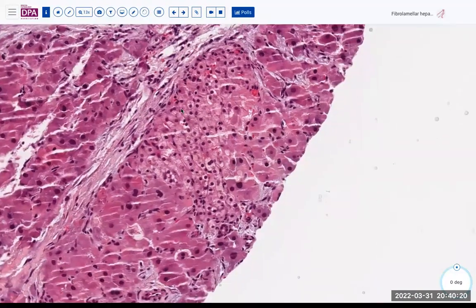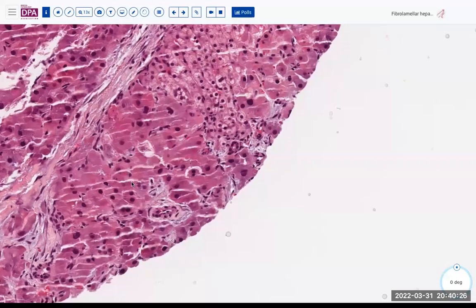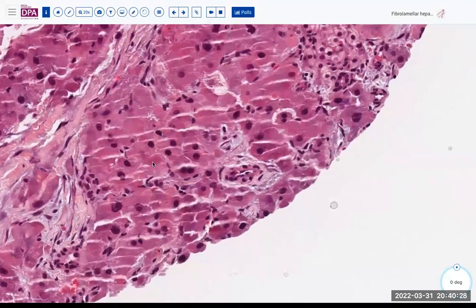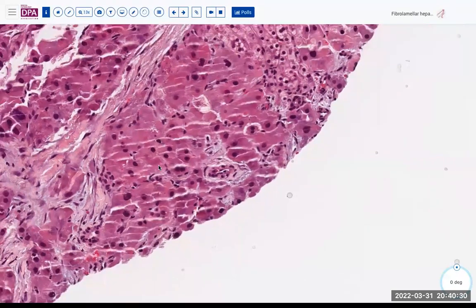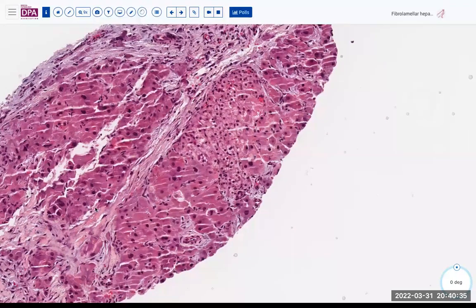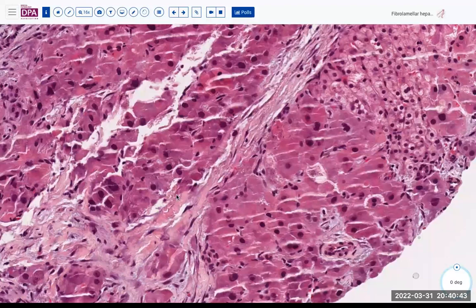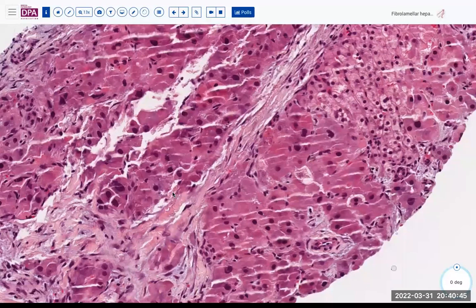These cells are not as red as those, but they're certainly very pink, and there's a lot of cytoplasm. I think you would agree these kind of look oncocytic in this pattern. And here we do see these little strands of collagenized fibrous tissue in between and around some of these cell groups. Nice collagenized tissue there.